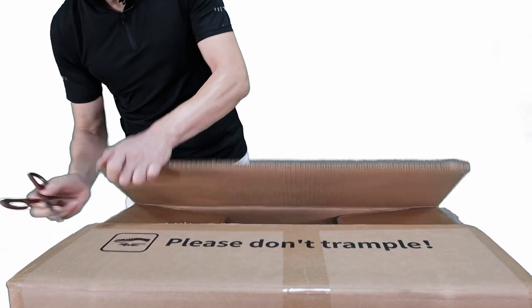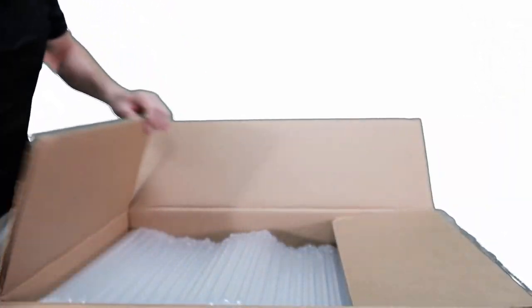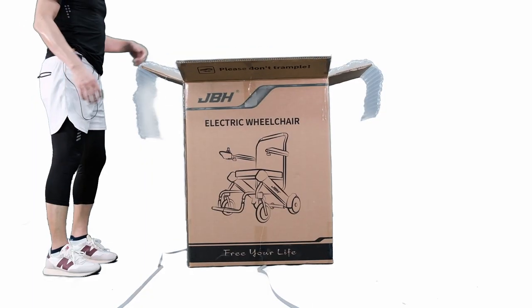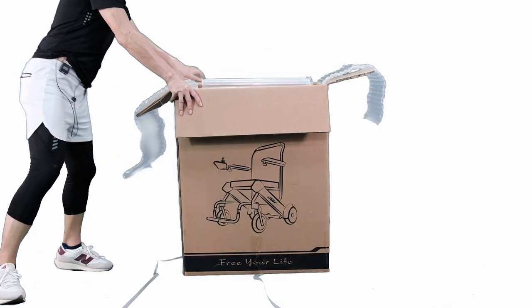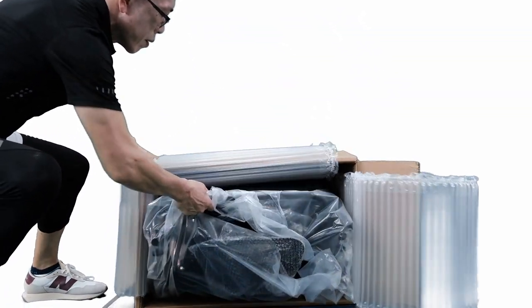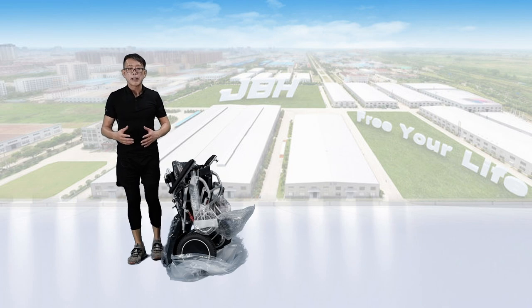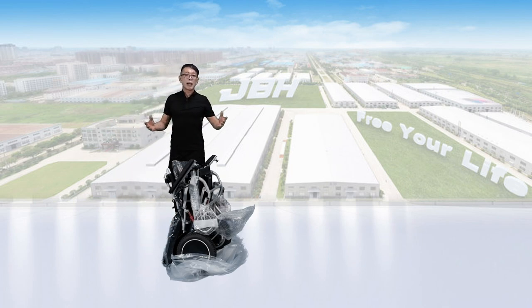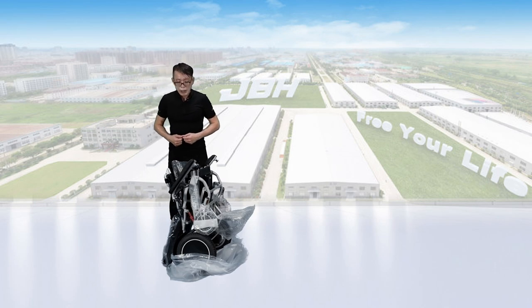Simply open the top of the carton by cutting the tape and the strap so we can open up the carton, then lay the whole carton down. It's much easier for us to check out the units. We have already got the wheelchair out of the carton. First, let's check out the accessories we have for the initial setup.